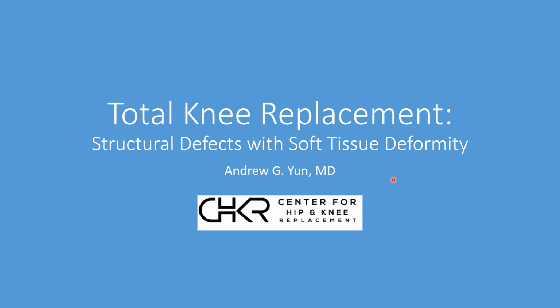Okay, so that's a brief overview with the very complex knees. Routine knees are much more straightforward, but it shows the power of preoperative planning and the anticipation of structural and soft tissue defects, and the importance of soft tissue adjustments or small adjustments in angle and in depth to ensure that we're able to reproduce symmetry and restore alignment.